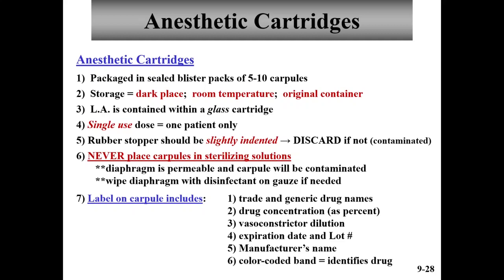So if for some reason the cartridge becomes contaminated, you drop it, or it rubs up against something, take a cotton gauze with disinfectant on it and just wipe it across the carpule penetrating end.